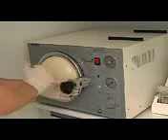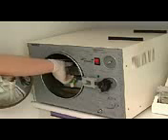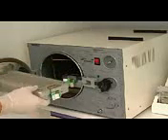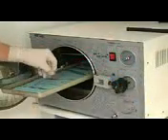After sterilization, the containers are removed from the autoclave, and the surgical instruments are prepared for upcoming patient treatment. In the picture, you see a surgery container in which the instruments are neatly stored. Doctors' offices do not usually use surgery containers.